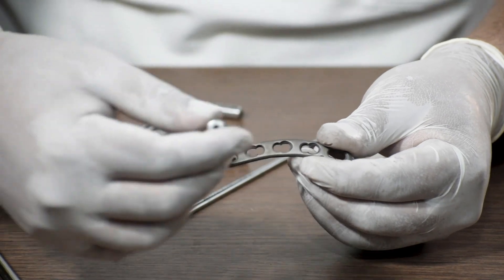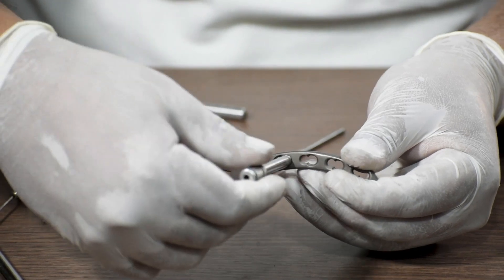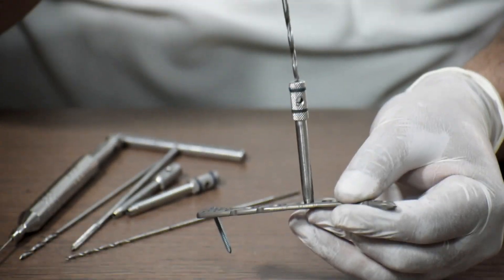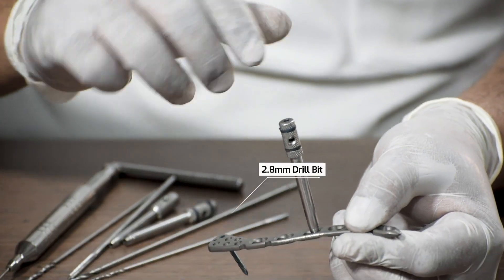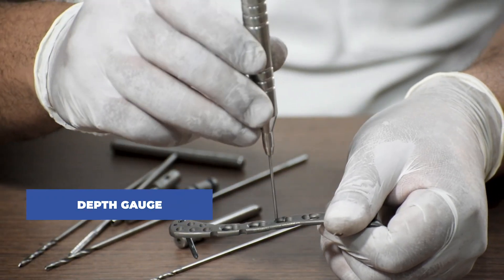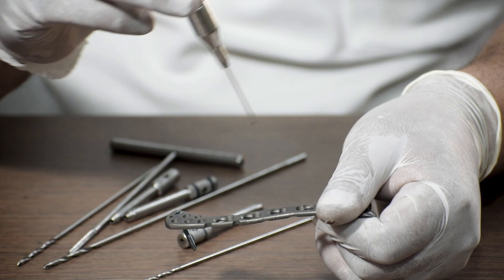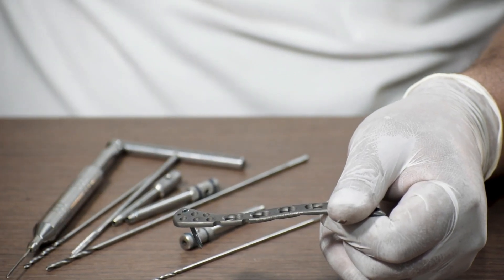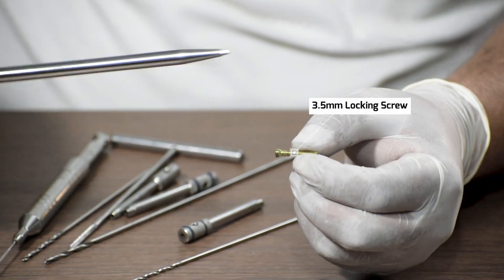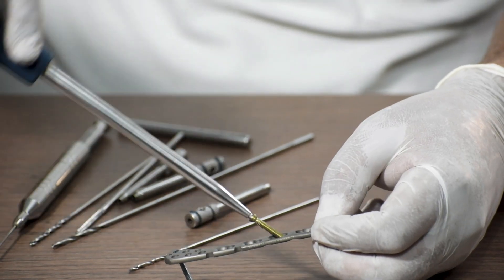If the surgeon wants to fix a locking screw in the shaft region, we take a 3.5 mm locking drill sleeve and fix it in the locking hole of the shaft region, then drill through the sleeve with a 2.8 mm drill bit. After drilling, we use a depth gauge to measure the length of the screw needed. Then we take a 3.5 mm locking screw and with a 3.5 mm screwdriver fix it in the drilled hole in the shaft region of the plate.